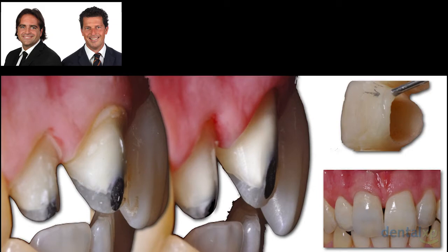We thought about the patient. Any patient doesn't like to see us taking the blade out of our bench. So it's important that, if we have the possibility, we don't use the blade, and we solve gingival asymmetries prosthetically when it's possible.